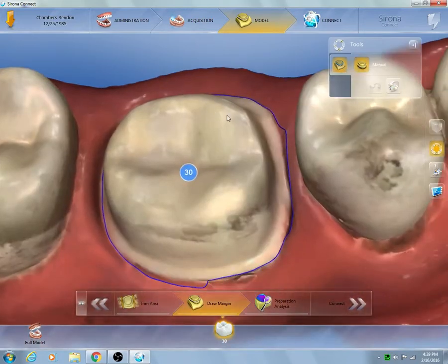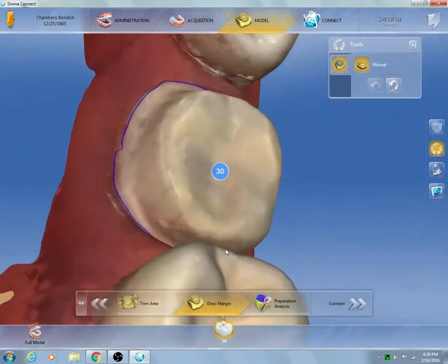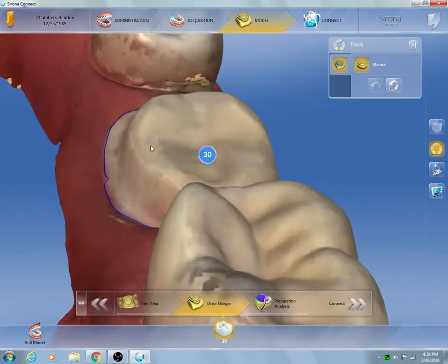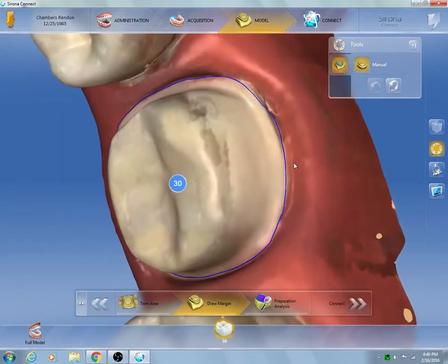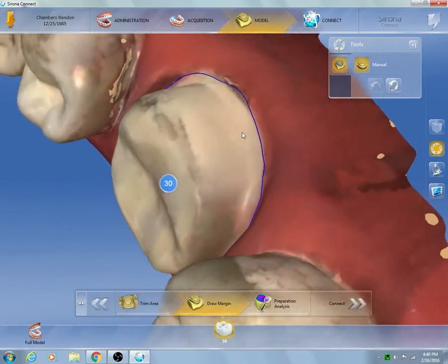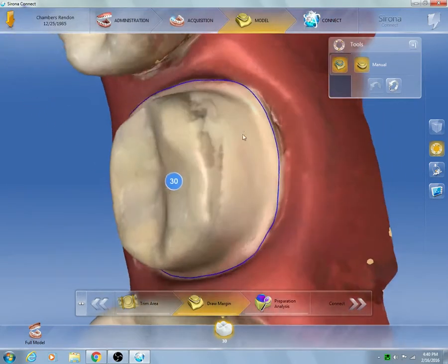At this point I can see the margin line that it auto-generated for me. I can double-click on the blue line and do several single clicks to continue drawing where the margin actually is if it got off a little bit. When I re-click onto the blue line, it will reroute the previous blue margin line to where I desire it to be, shown in white. Once I go around, I re-rotate to make sure I am on the margin area. If I'm off, I simply click again to get the margin drawn as needed.